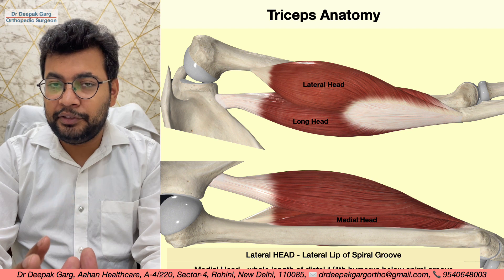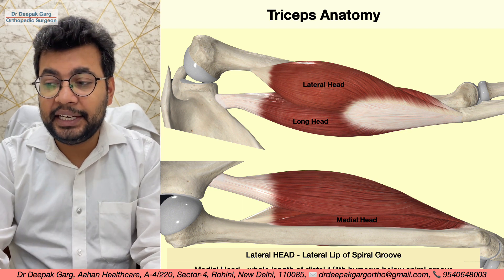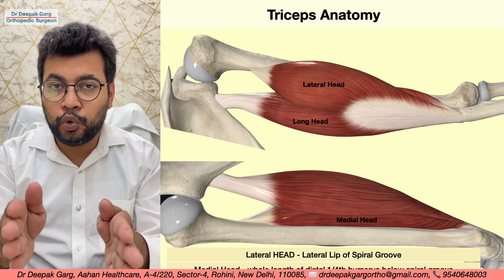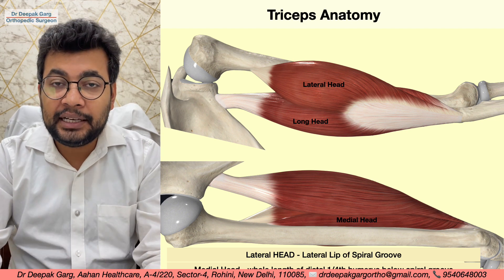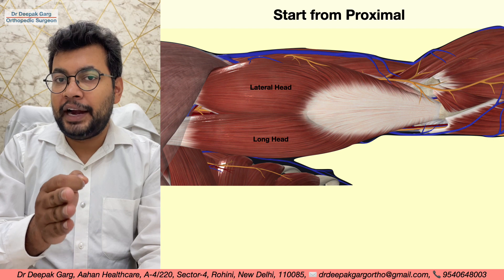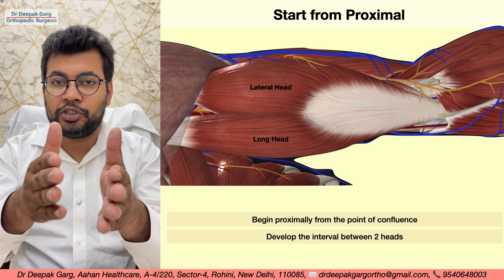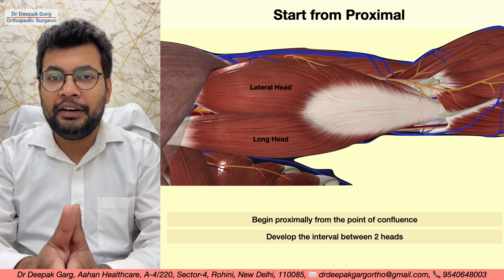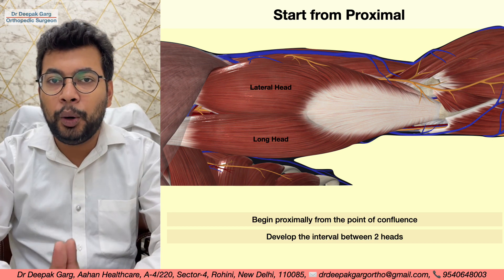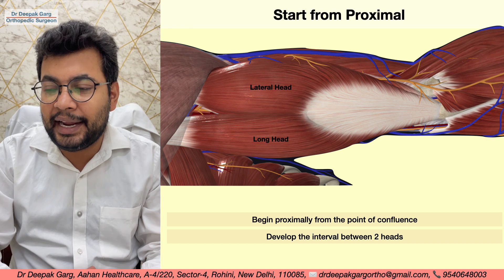We need to identify the gap between the lateral head and the medial head. Once we incise the deep fascia and expose the triceps, we identify where the lateral head and the long head are fusing. Our main goal is to first identify and separate the radial nerve and the profunda brachii vessels. We start from proximal, identifying the point of confluence where the two heads meet, and work from above that point going proximally to identify the nerve first.